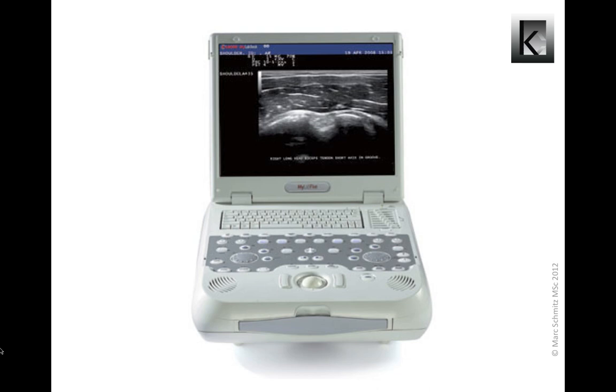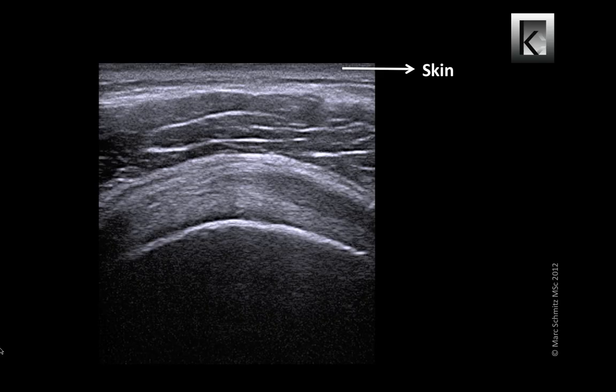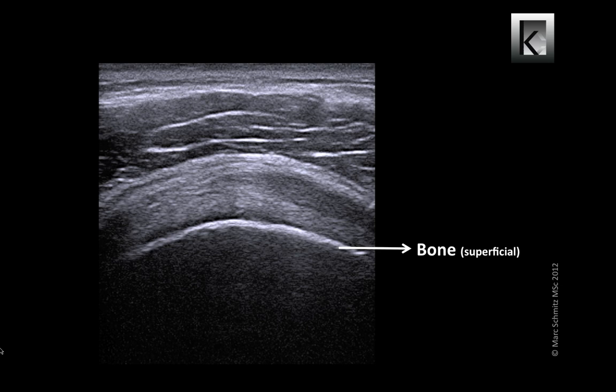These soft tissue structures can be assessed with MSU. For example: skin, muscle, bursa — which can be better depicted when inflamed — tendon, and the superficial bone. Do you know which body part this is? It's the shoulder. To be precise, a transverse scan of the supraspinatus tendon.